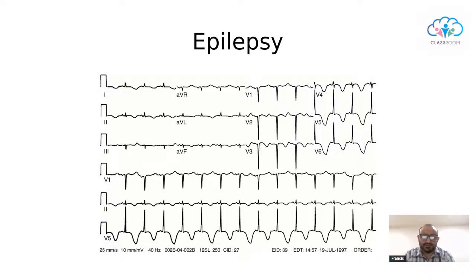This is a classical T wave alternans where you can see every alternate T wave amplitude varies. You can see global T inversion.